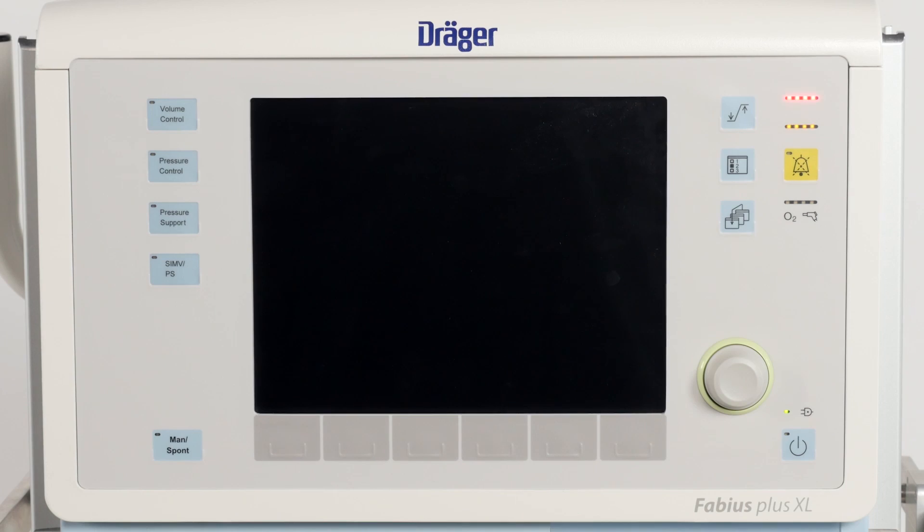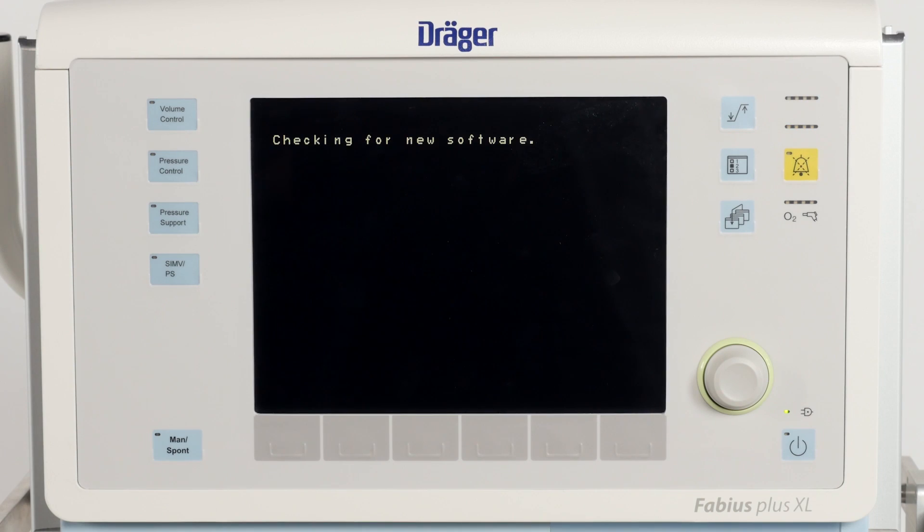Switch on your Fabius and wait for the system diagnostics to be carried out automatically.